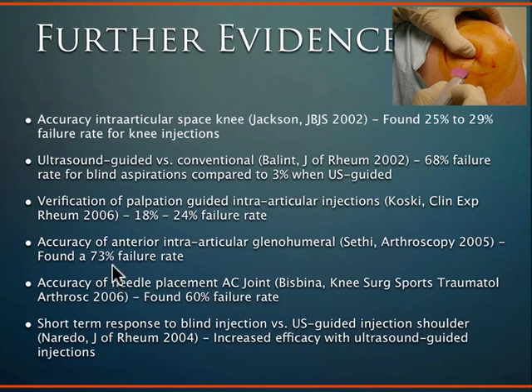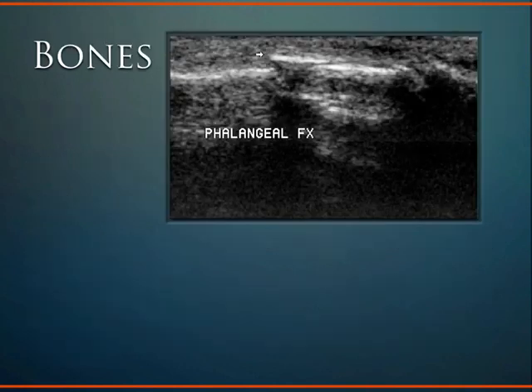Now these are maybe some outliers, but still alarming, how potentially inaccurate we can be with our blind injections, as opposed to ultrasound guidance: 68% versus just 3%. It's strikingly different. And so using ultrasound guidance is starting to become a standard of care for most joint and soft tissue injections as the modality grows and as more practitioners become comfortable with it.